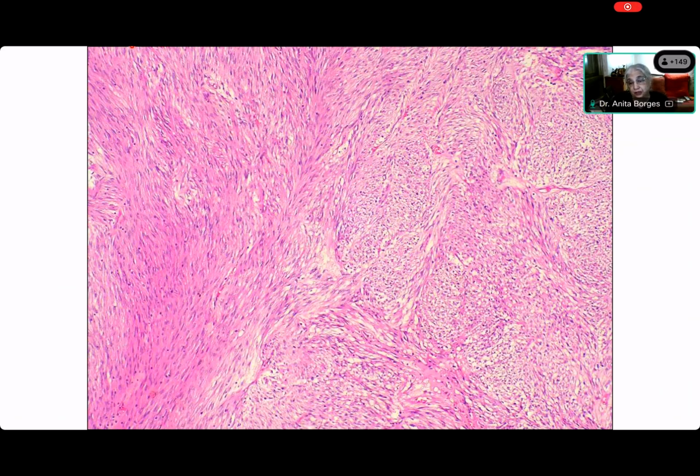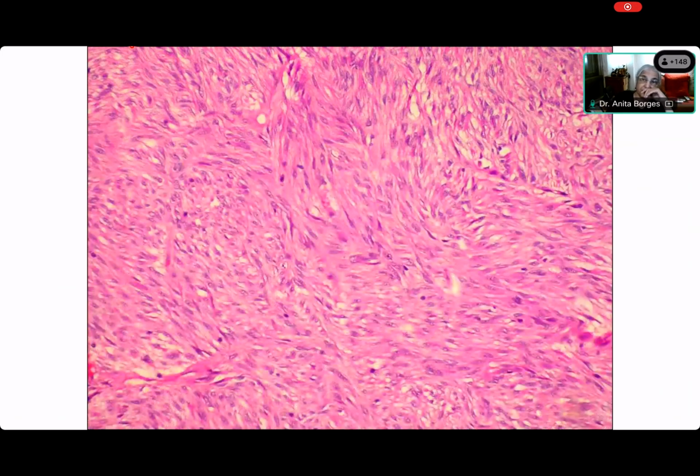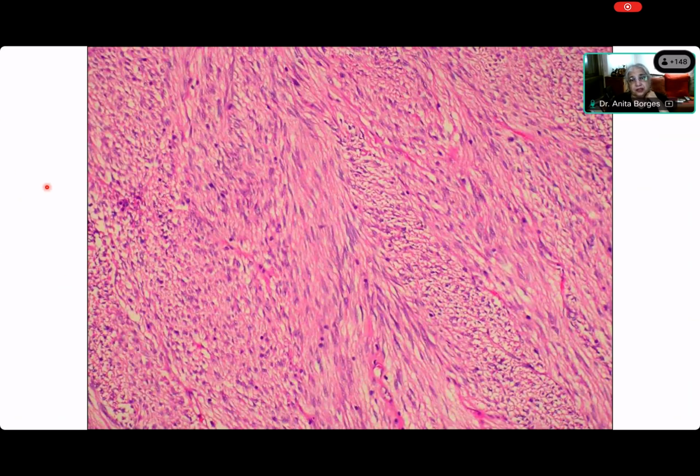This is fascicles. If you want to say that they may be in sheaths, I will agree, because these are fascicles that are cut in many different directions. This is a spindle cell tumor, without a doubt. Anything you want to say about the cytoplasm? Abundant cytoplasm. Is there anything else? It's deeply eosinophilic, very pink. And please see how you have fascicles and some of them are cut obliquely or transversely. That's why you get areas where the nuclei look round.